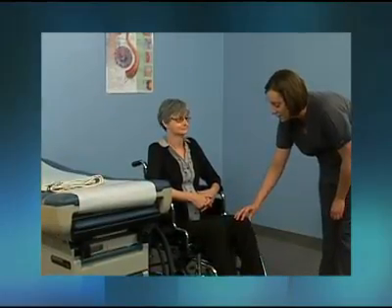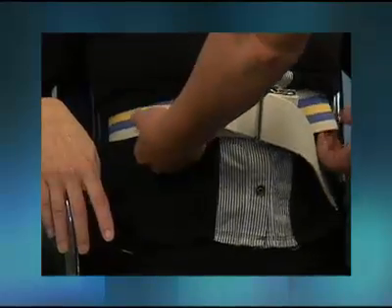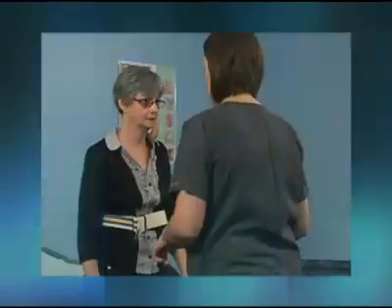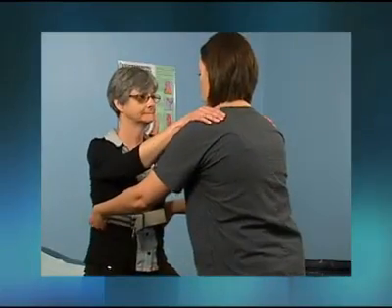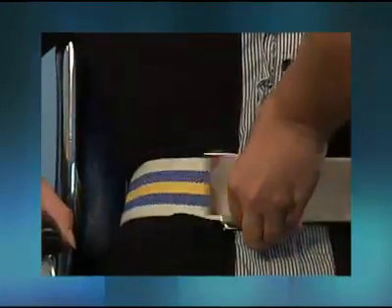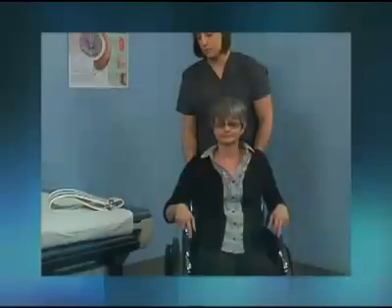A wheelchair helps individuals remain mobile when they can't walk or have difficulty walking due to illness or disability. Some patients who come to the medical office in a wheelchair are able to transfer themselves from a wheelchair to an examining table. However, others may need assistance. The medical assistant plays an important role in the transfer of a patient safely and efficiently from a wheelchair to an examining table and back again.